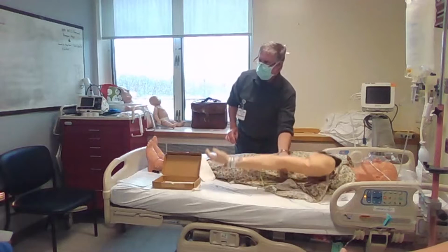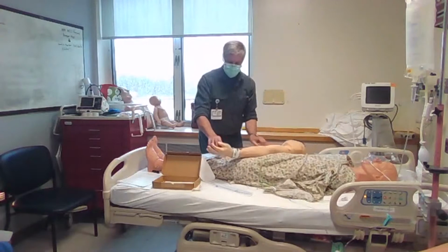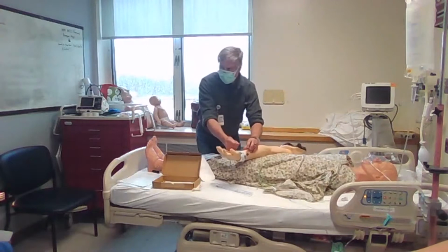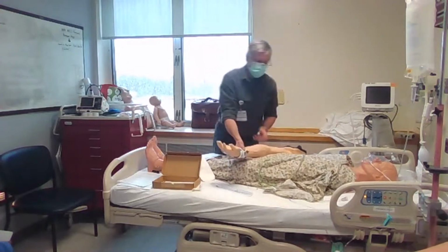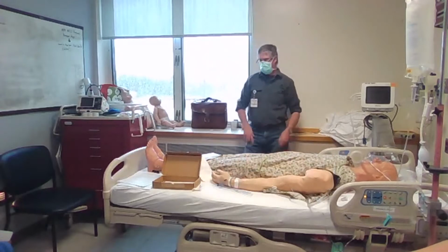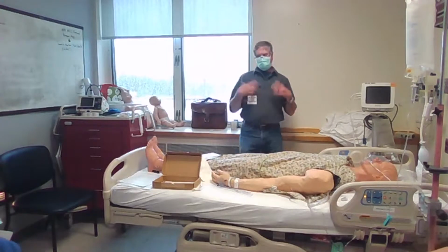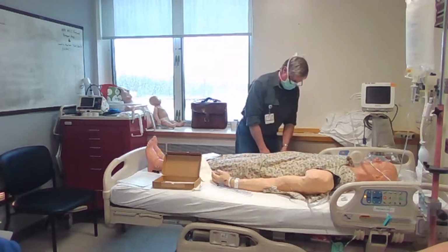Yeah. Okay. Like you would do it from the inside, I'd be sitting here like this because I'm going to go like that. You're not working against yourself. So for me being left-handed, I'm going to use the right side of the body, if I'm going to shoot for the radial, or make it so ulnar, so that you're not working against your own body to be able to get anything, because you want to get it and you want it to be easy.